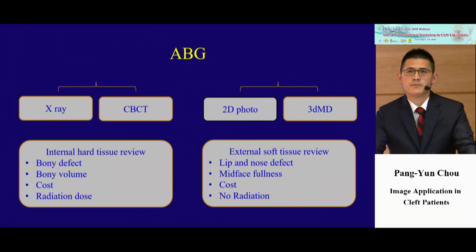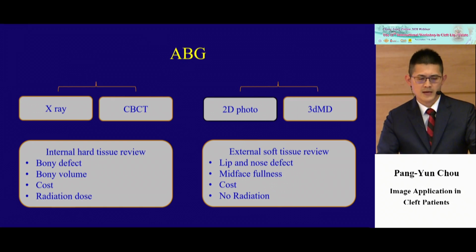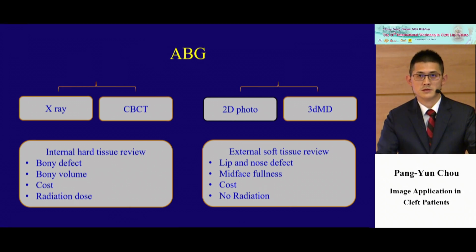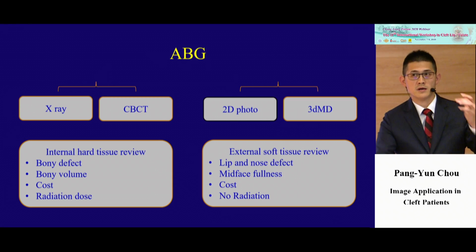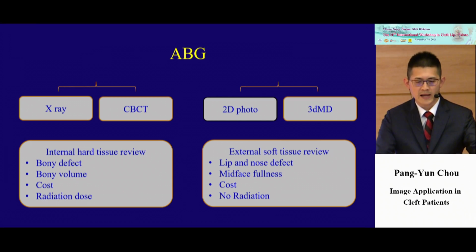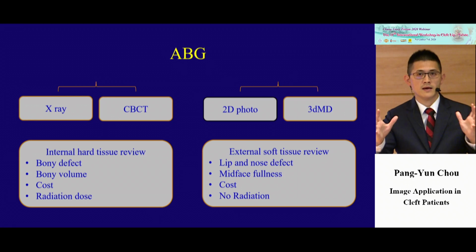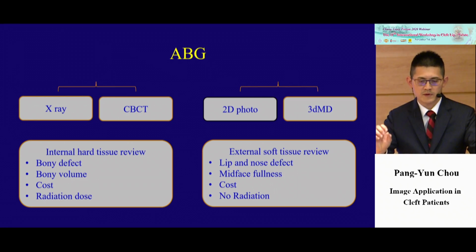For the bony defect, we can have an X-ray or cone beam CT. For the external facial appearance, we can check with a 2D photo as well. If you have a more advanced modality, you can apply 3D imaging, like 3dMD images, to check in more detail from multiple views, before and after, to see the success or change from the surgery.